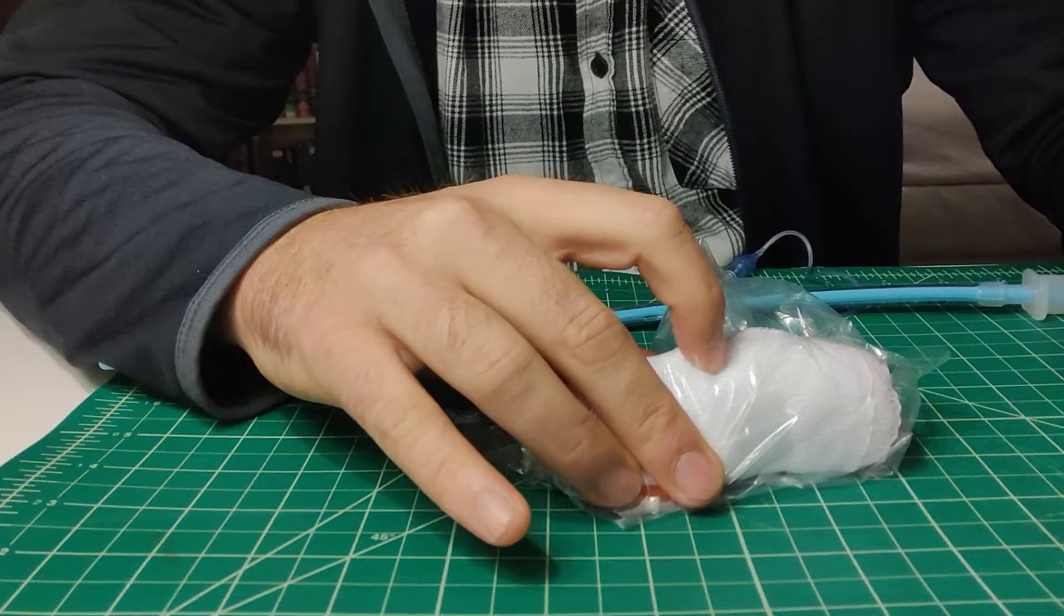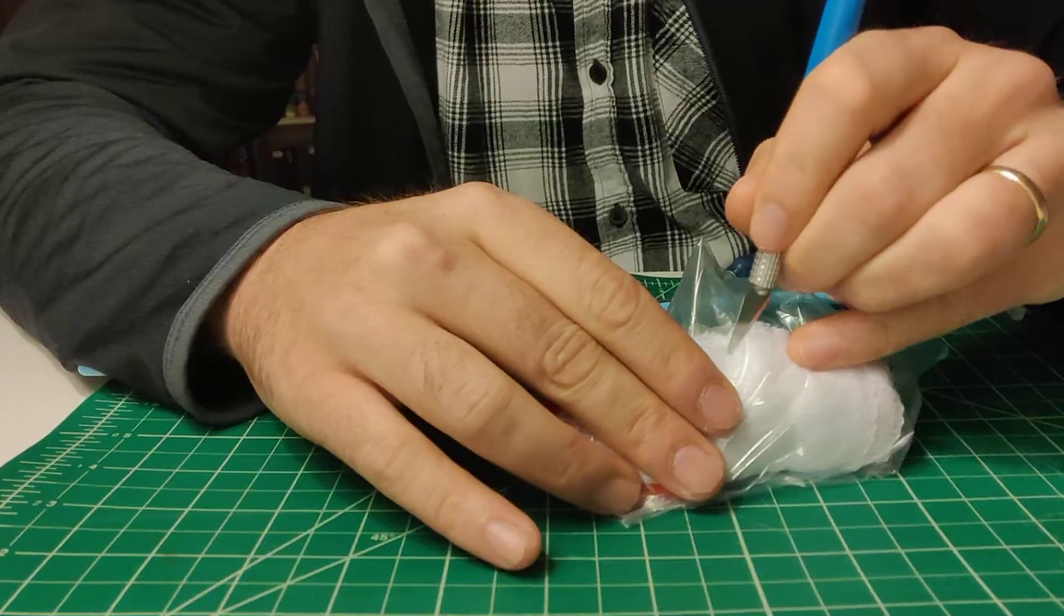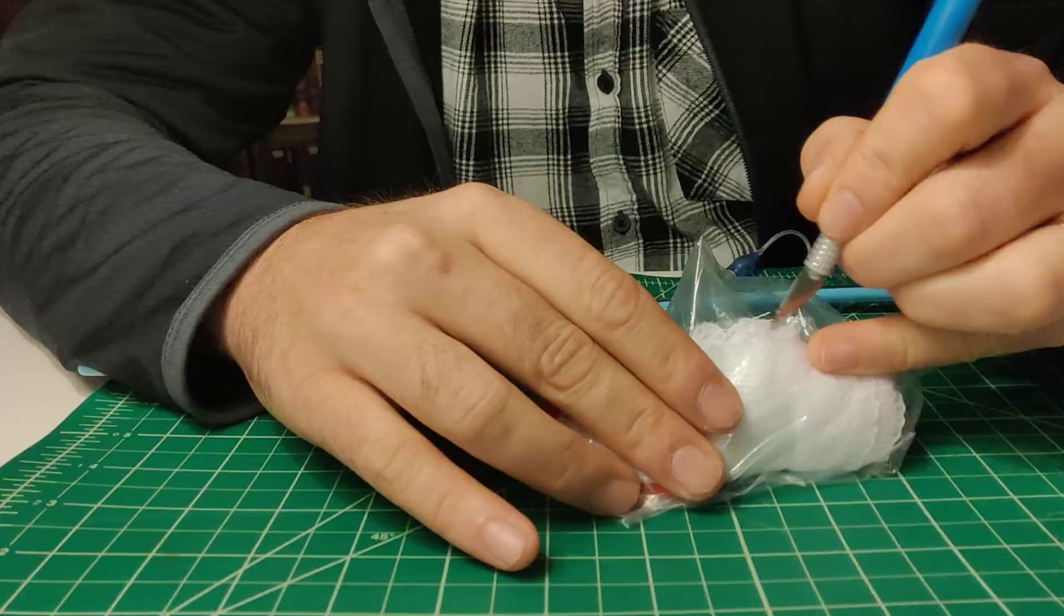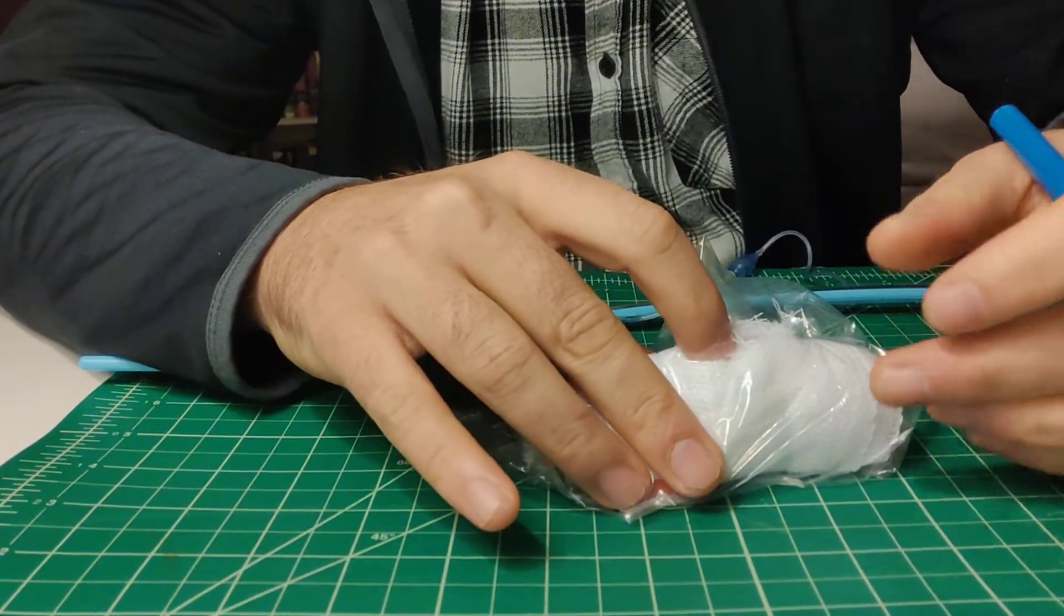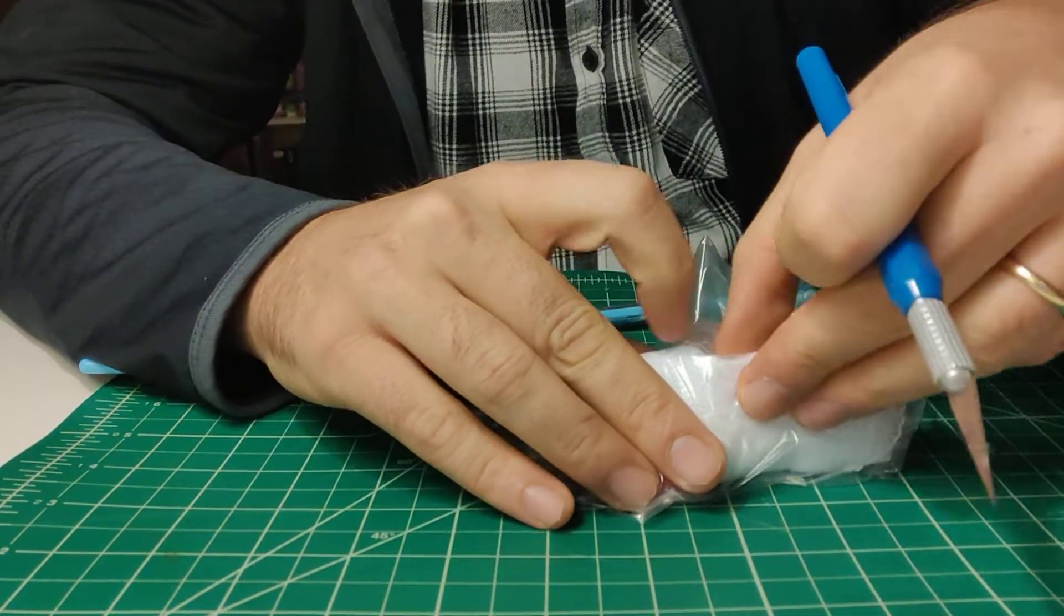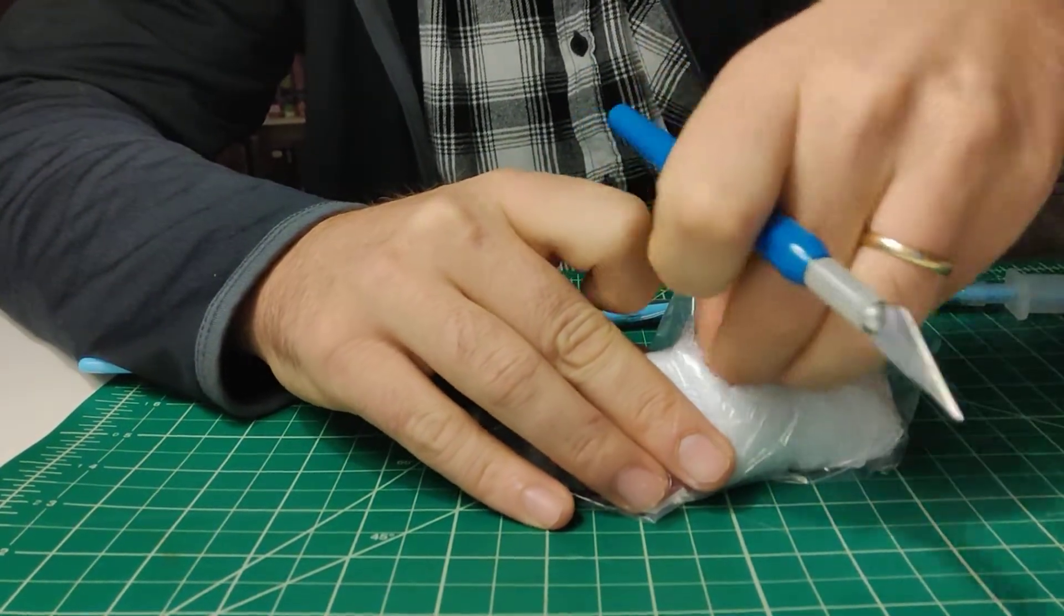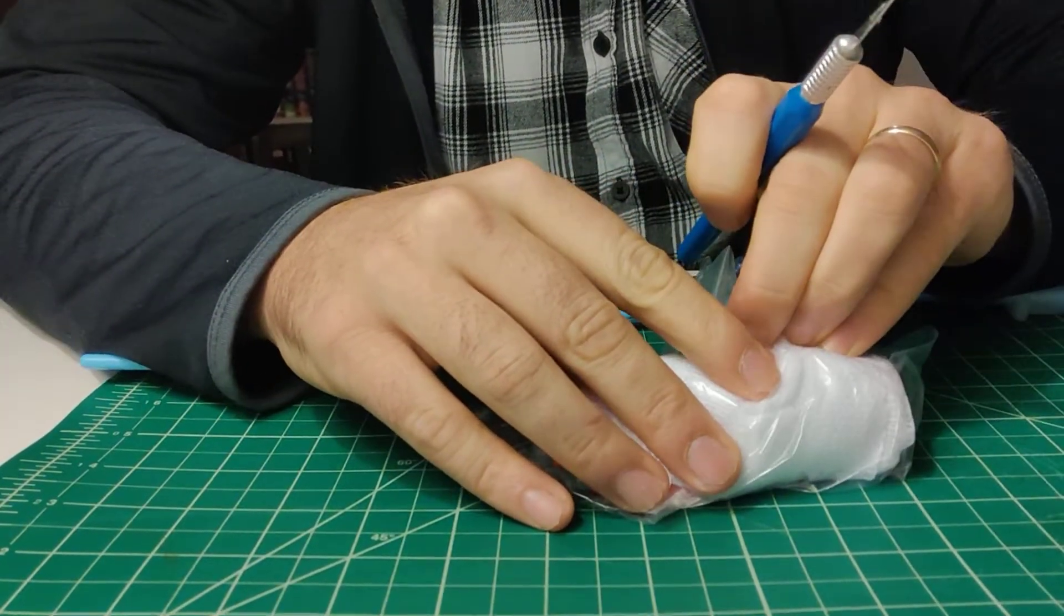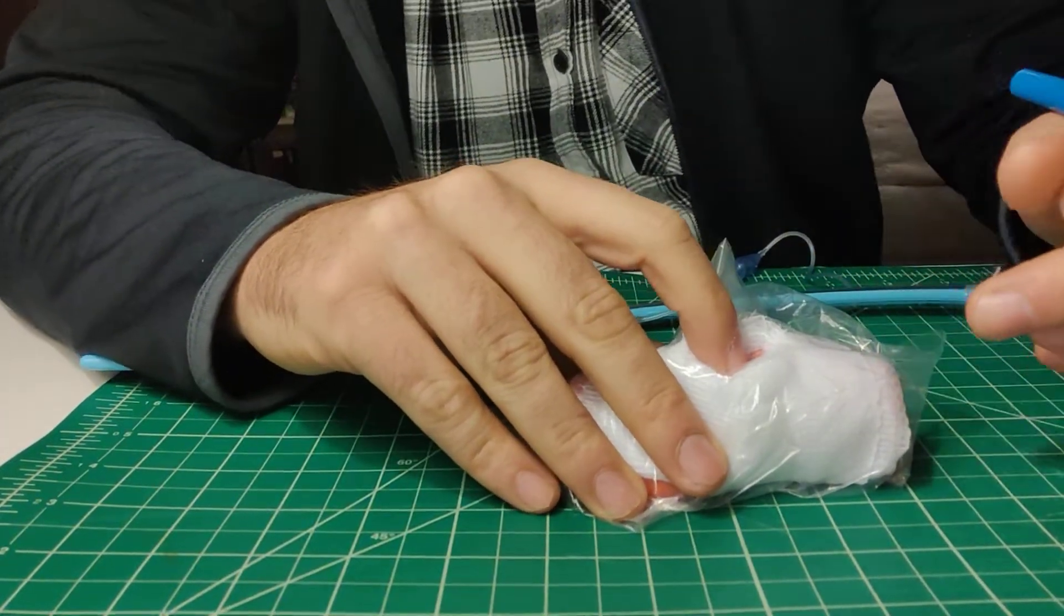Once you've made your initial incision, you can go and then repalpate. If you don't really feel cricothyroid or you think you need to go a little deeper, you can cut a little more, which is what I'm going to do because these four by fours suck. All right. And then go in and repalpate again. This is where you can also, I don't use hemostats. I'll talk about more why later. But I go in here and you can bluntly dissect with your other finger like this. Again, this is an aggressive procedure. You'd be surprised how much force is needed, especially to get your finger into the cricothyroid. So you can use your fingers like this to bluntly dissect and then repalpate until you feel like you're pretty good.